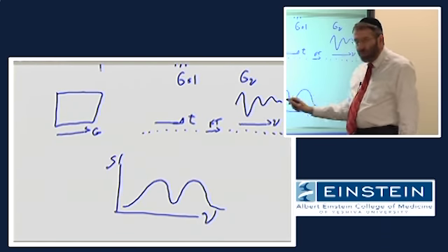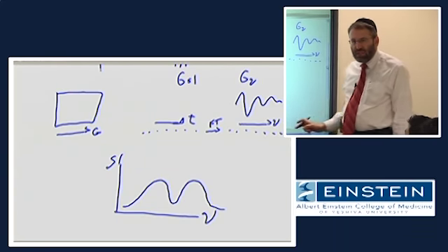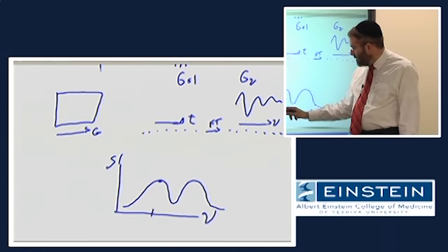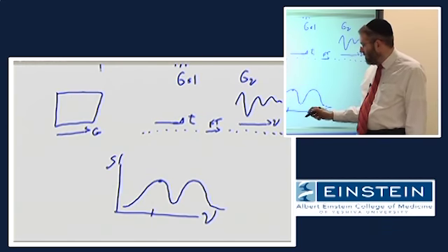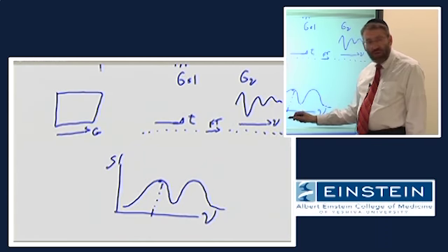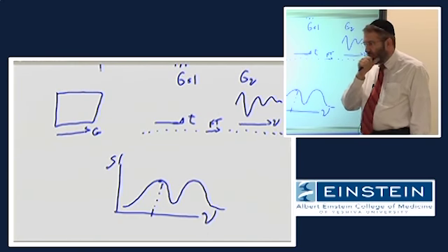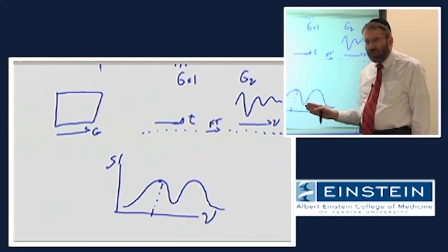So this tells us information about the spatial distribution of signal along a single linear dimension. But all it tells us is that in the center of this leg, we have this much signal amplitude. We have no way of knowing at this point where different amounts of that signal come from, even though certainly some of it comes from bone, and some of it comes from muscle, and some of it comes from cartilage, and whatever else. That's the task of our next step.